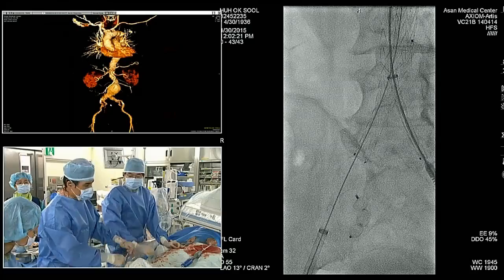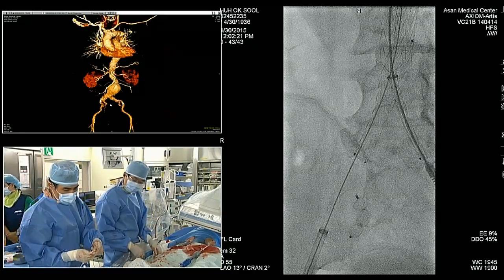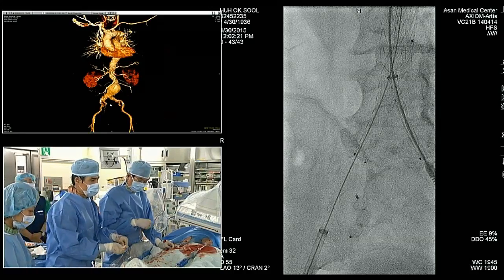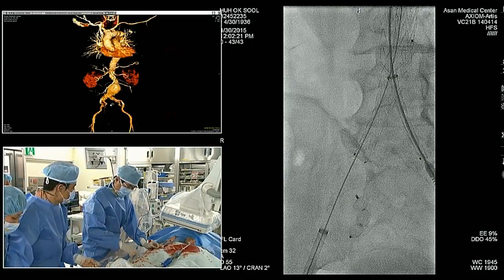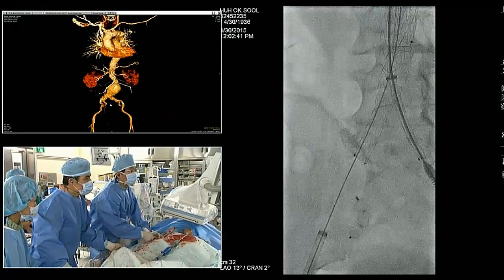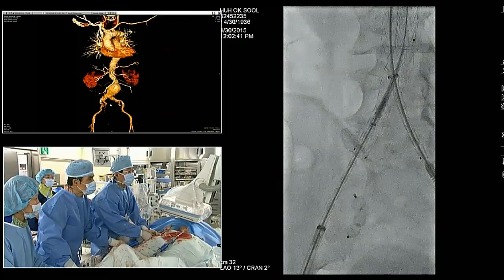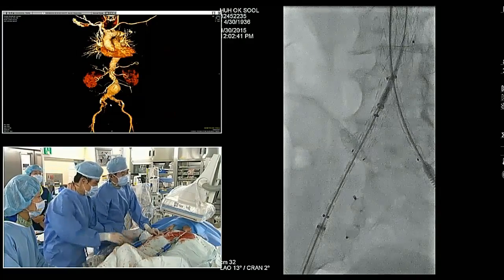So now we use another contralateral limb extension. The diameter is the same for the proximal and distal, 10 millimeters. So 10 by 80 millimeters length. Yes, 10 millimeter diameter for the external and then 80 millimeters long. Plenty long. Implant. Slowly. Notice he's getting a good amount of limb overlap, junction overlap.